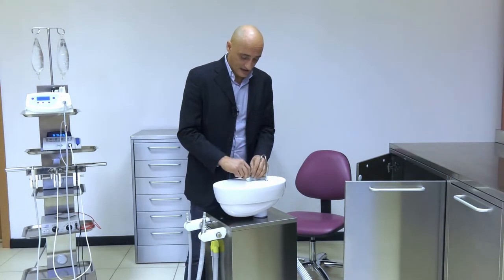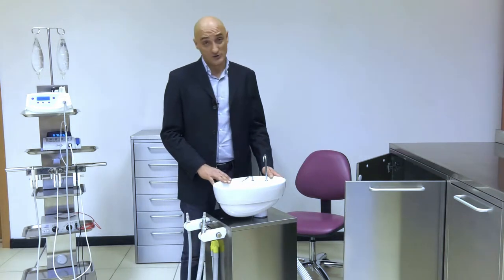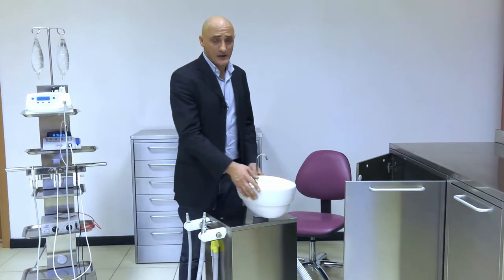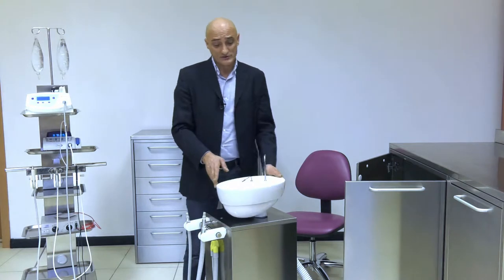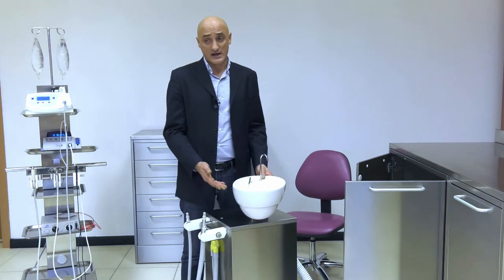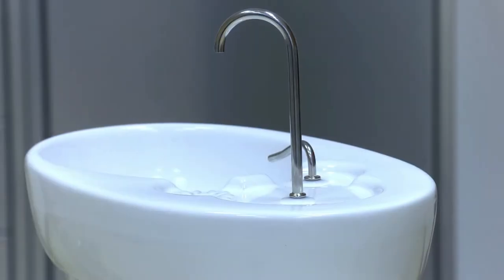Moreover, the cuspidor, just like mid to high end orthodontic units, can rotate 180 degrees. Thanks to this, the Aspirol can move as close as possible to your patient's mouth and rinse it.